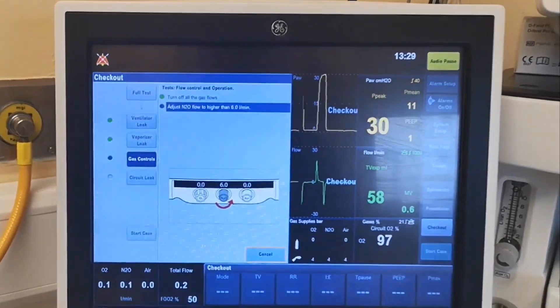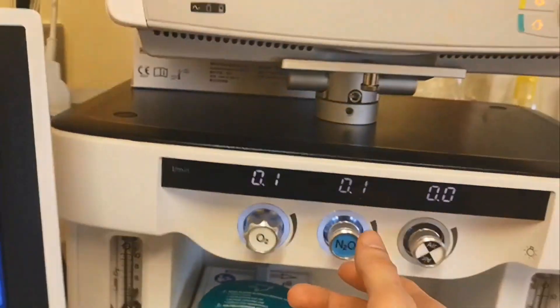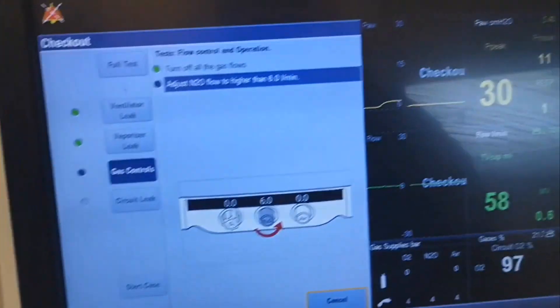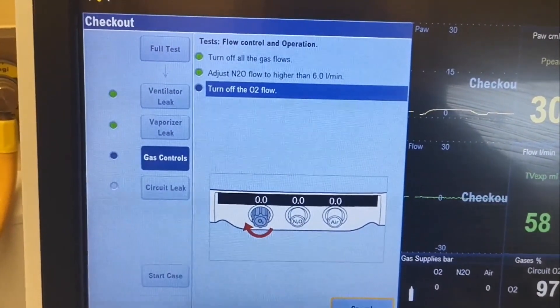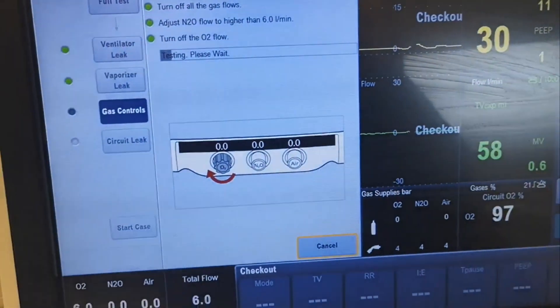Now it's asking you to check the flow meters. Check up to 6 — there you go. Now check the oxygen and turn it down to 0.